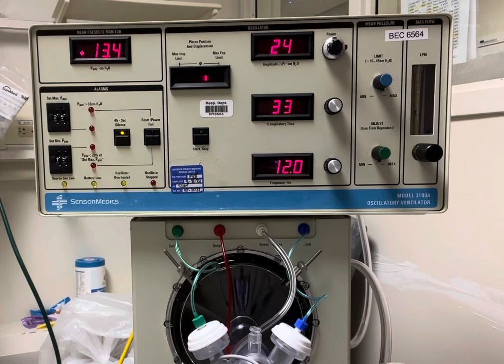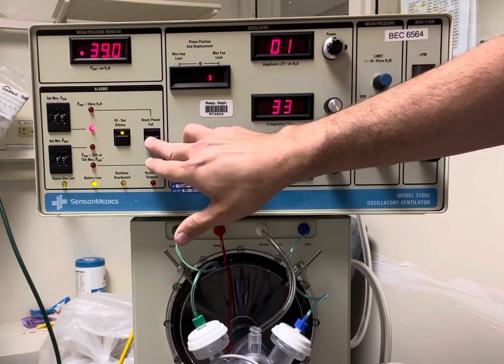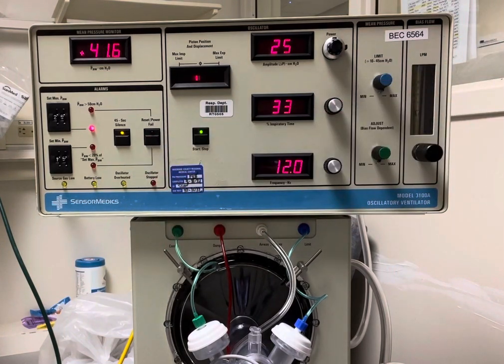So once that is confirmed, we go ahead and start up the machine. You'd hold this down and then press start, and then we have it going.